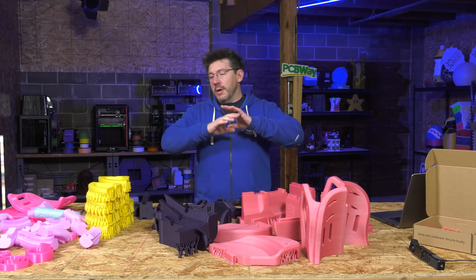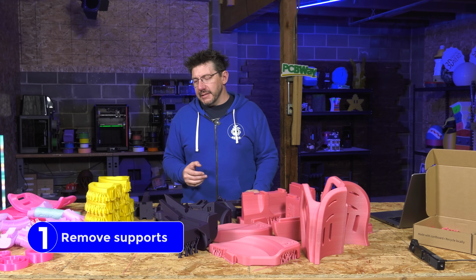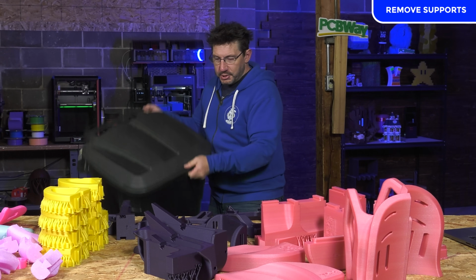The first thing you want to do, once you have all of your parts, is take the supports off. What I would recommend, or at least how I went about things, is getting the supports off of everything. In doing that, it allows you to get all of your pieces ready. I've got a trash can right here. Take off your supports, throw them away.